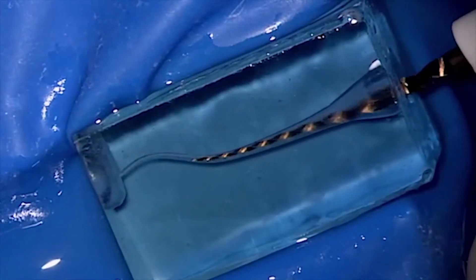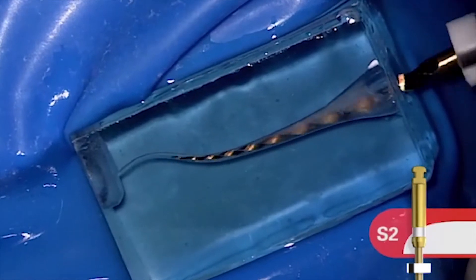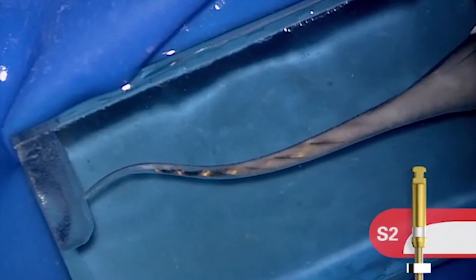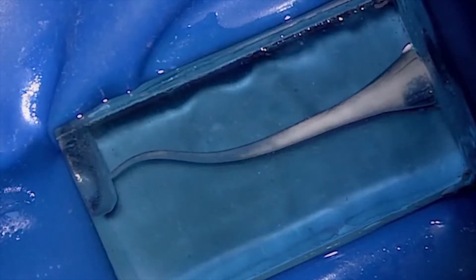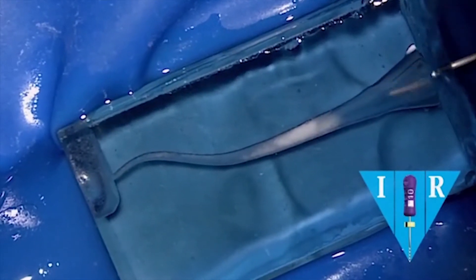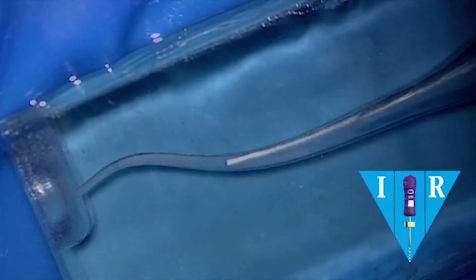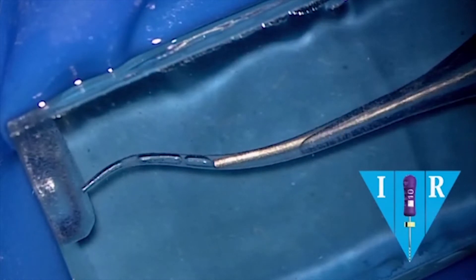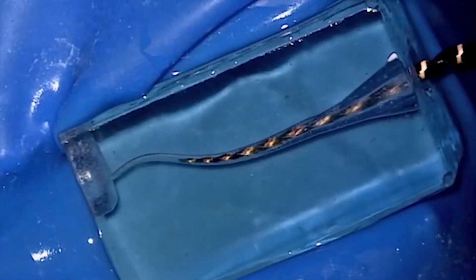You can bump these solutions and notice we're moving solutions much deeper than the placement of the cannula. Here comes the S2. It'll carry a shaping wave progressively deeper into the canal and it'll work primarily in the middle one-third. Again, the tip of the file is dominantly loose and the shaping is continuing. Irrigate, recapitulate, and re-irrigate. I'm using a needle or cannula that is cut 90 degrees to its long axis — that means I can vacuum and I can bump solutions. I can actually move solutions many, many millimeters apical to the position of the cannula. This is a real advantage in irrigation procedures.